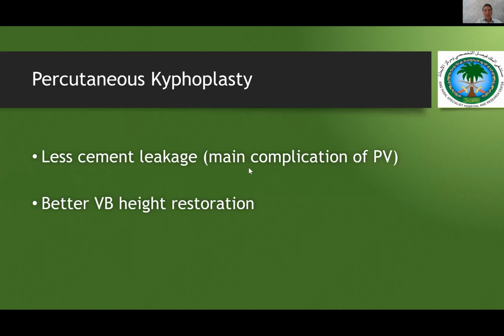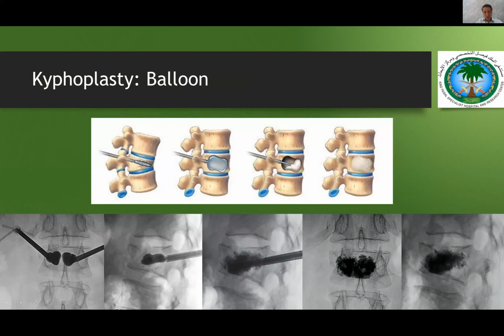Okay, just a few tips, mainly to decrease the cement leak after kyphoplasty. A couple of ideas behind it. It might restore height, but through this cavity, it decreases the risks. People invented polymer coils that you would deploy to support, and that also supports the bone. The one I did not mention is that you should know your device.